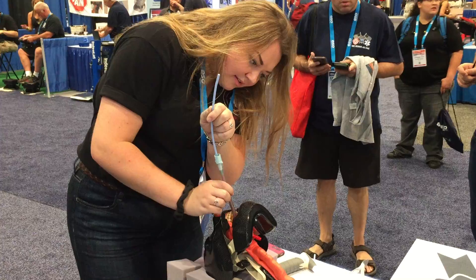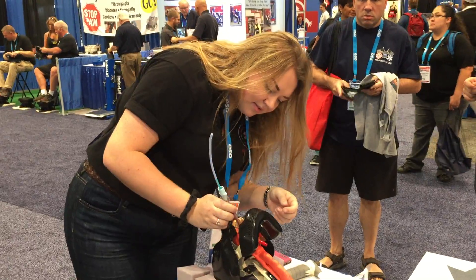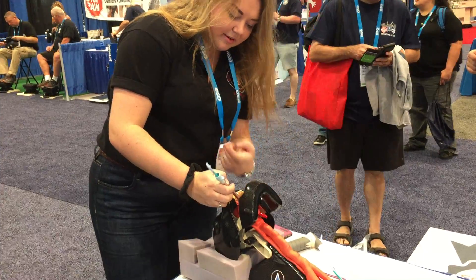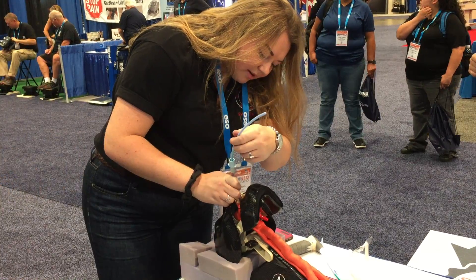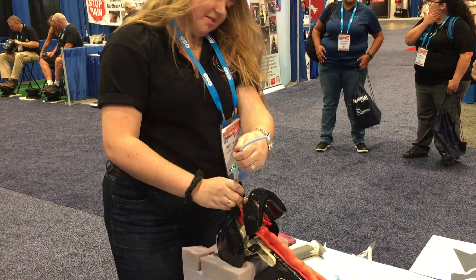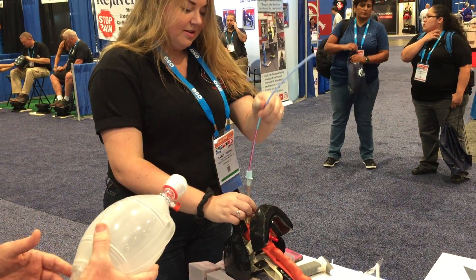You call it 22 to 24, whatever you want to do today. And where would that lie on there? Incisors. Both of these markers are going off of the teeth. Then I'll do 23. Right on. Then I pull this out? Yep, remove the bougie, and we're going to bag.